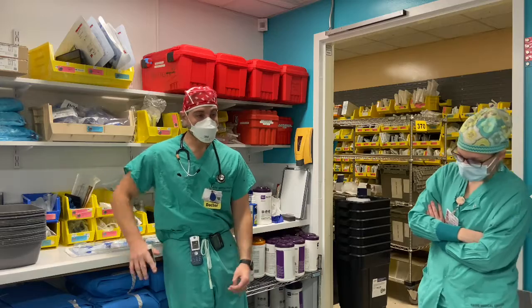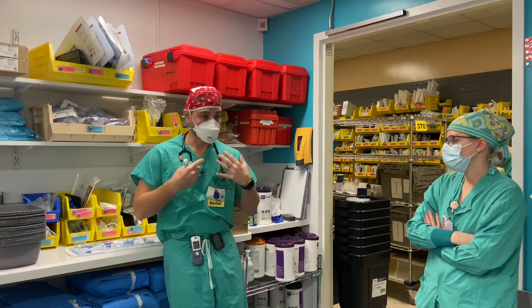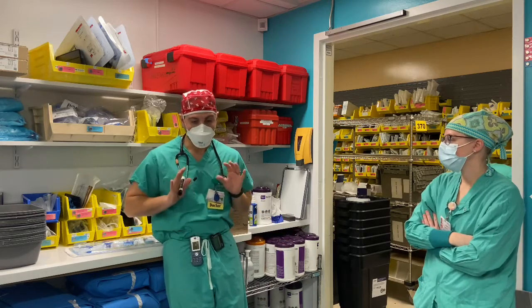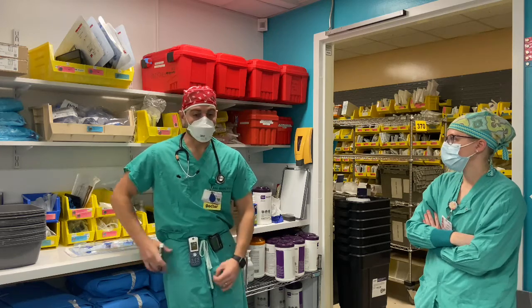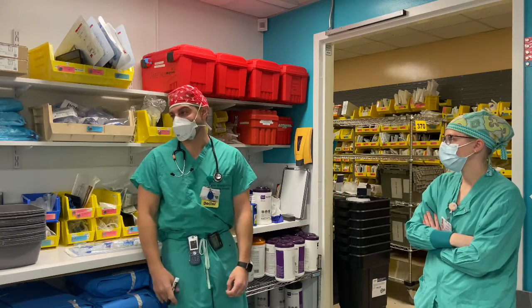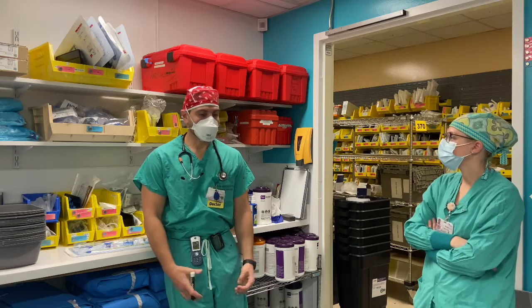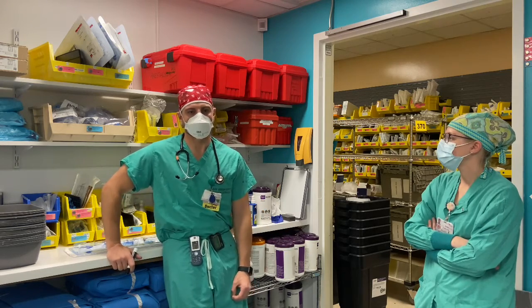Okay. So just to review what we've already talked about. Negative pressure inspiration is normal. That's what you're doing on your own. Positive pressure is when we need to help drive the air into the patient's lungs for various reasons. Because we're fighting against something, because we've paralyzed the patient and their own body's not working the way it normally would.